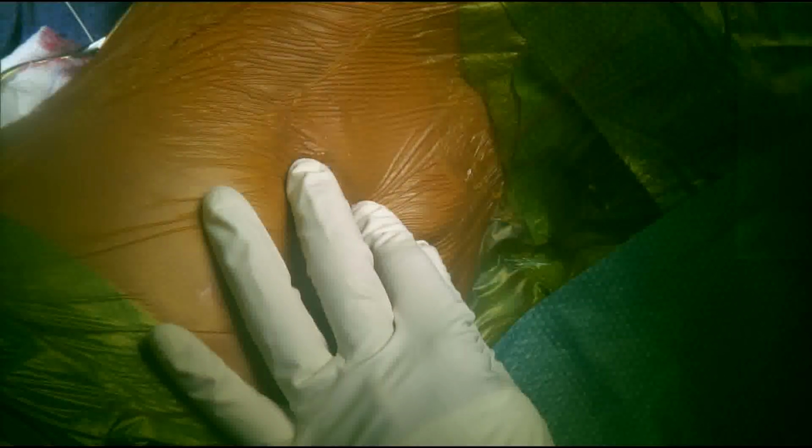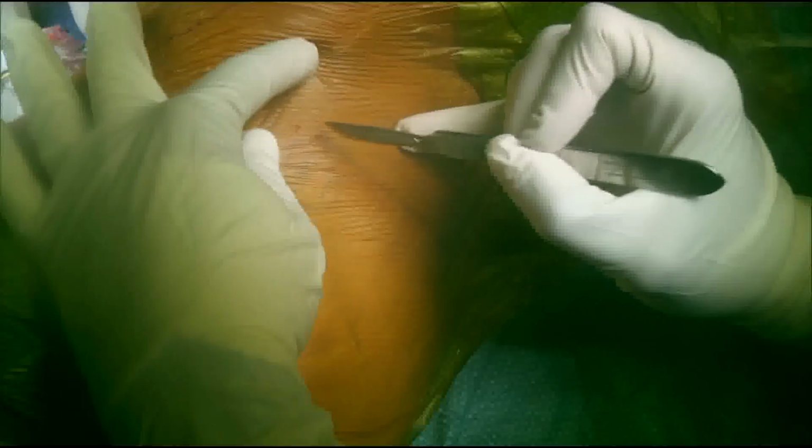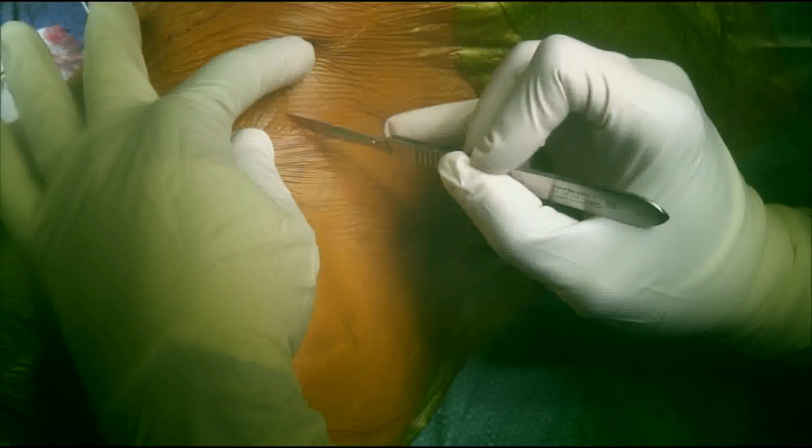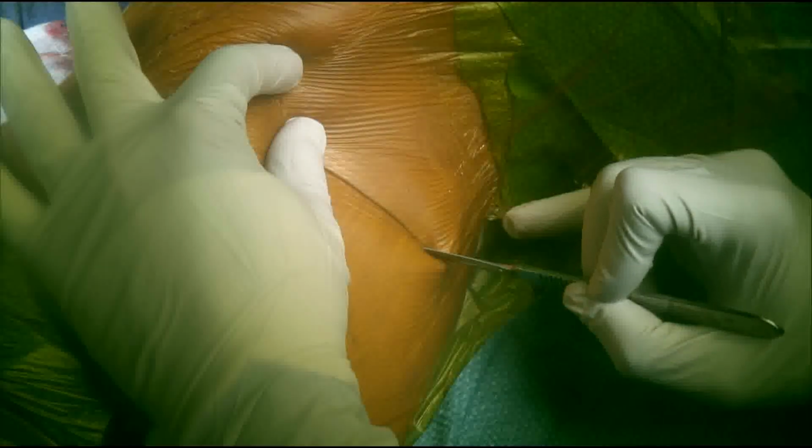While the abdominal pocket is being prepared, I am also removing the stylet from inside the spinal catheter, and additionally, I'm also removing the spinal needle. It is important to be cautious while removing the stylet, the spinal needle, and while fixing the spinal catheter to the deep fascia in order not to pull out the spinal catheter or to change inadvertently the location of the catheter tip.